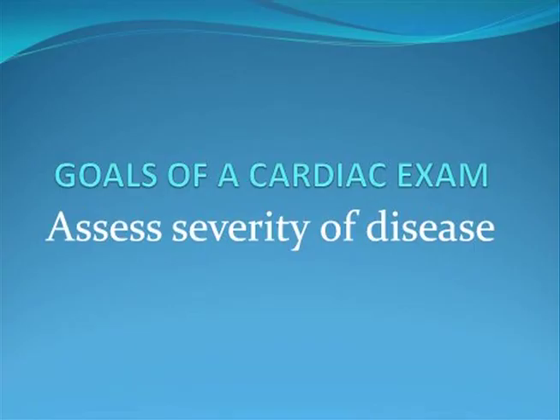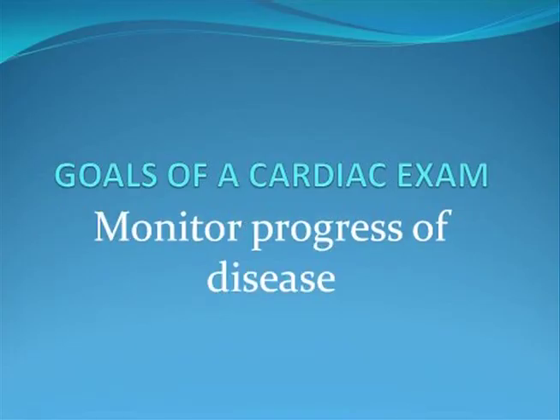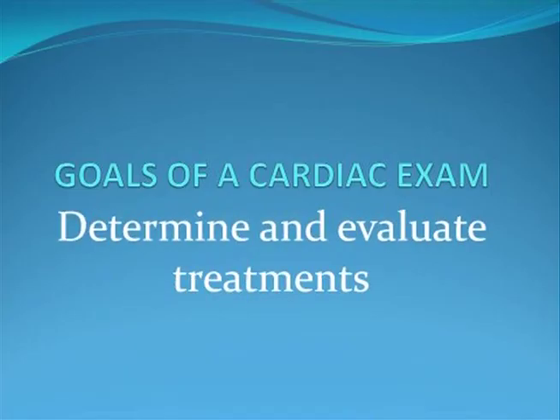Goals of a cardiac study. A. Assess severity of disease. B. Monitor progress of disease. C. Determine and evaluate treatments.